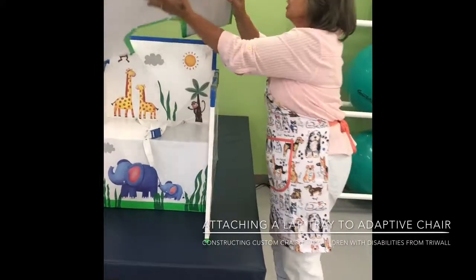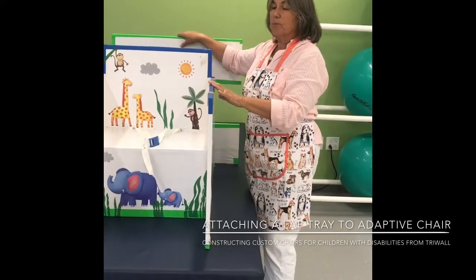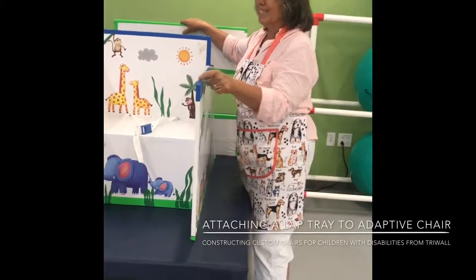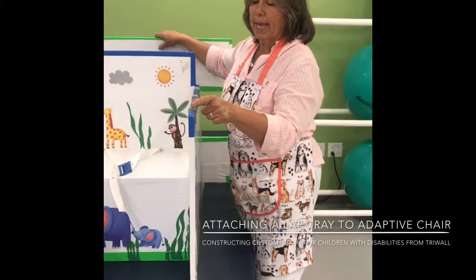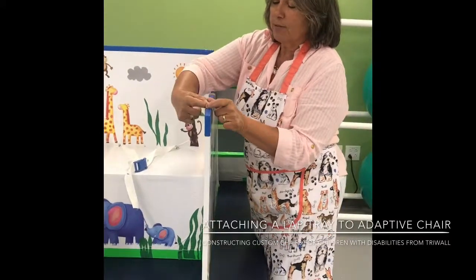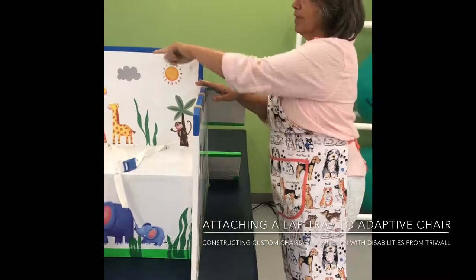Once you have these loop velcros on, you cut some hook velcro — just little pieces — and don't take the tape off them yet. Just take a one-inch piece of velcro and stick it here, stick it here, stick it here. Same thing on the other side.